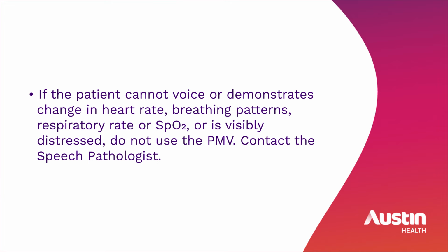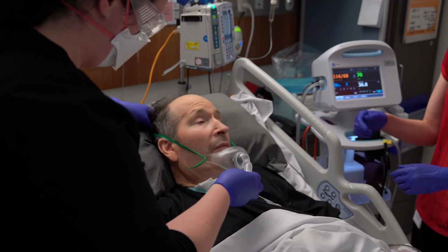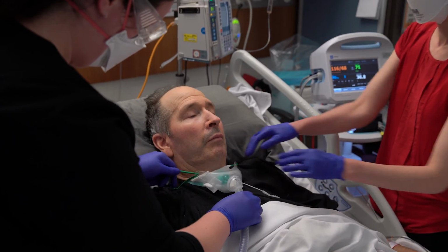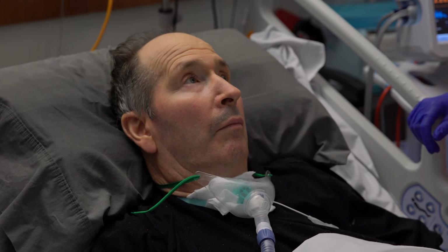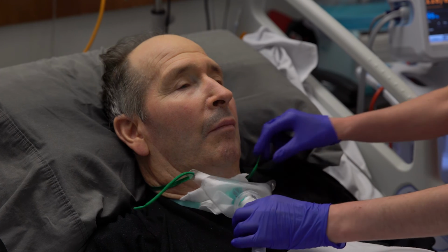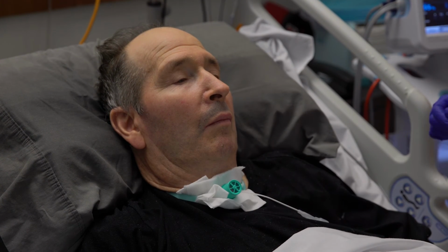Contact the speech pathologist. Monitor the patient closely for signs of intolerance of the PMV, such as increased work of breathing, respiratory distress, anxiety, increased coughing, or desaturation. Remove the PMV as per documented schedule or at any time that the patient does not tolerate the PMV.